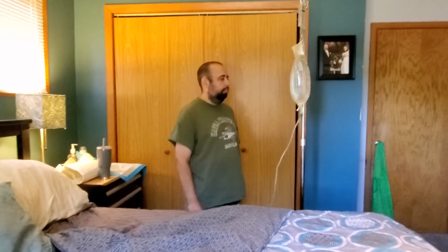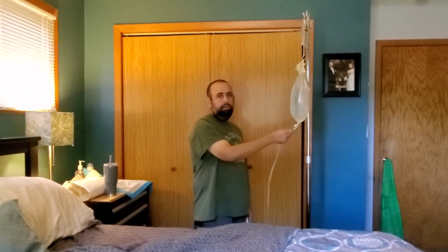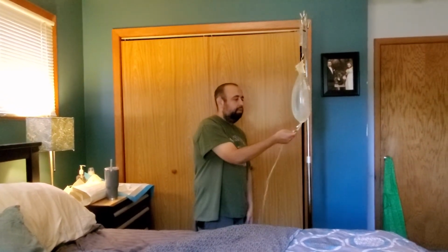Now we're ready for the fill. Now we're going to start the fill, and I'll break the piece here. Did you put the clamp on? Clamp is on, so we'll first break this piece.